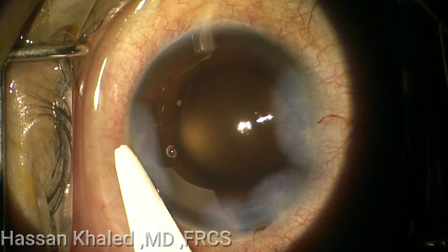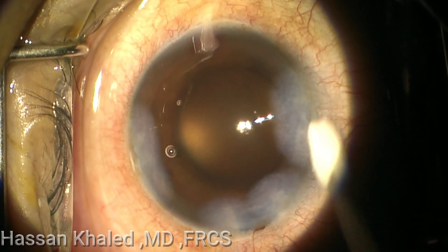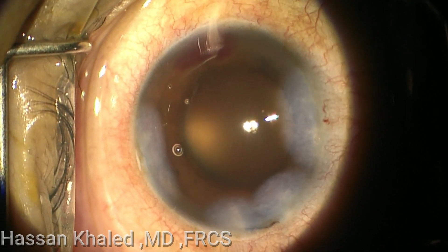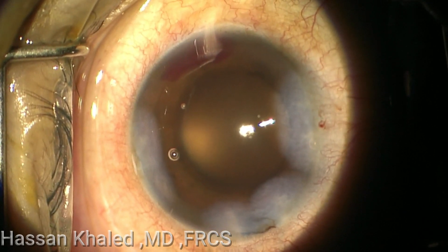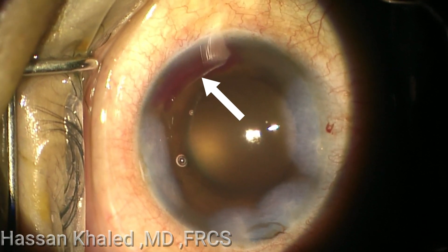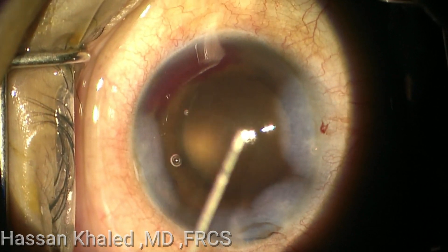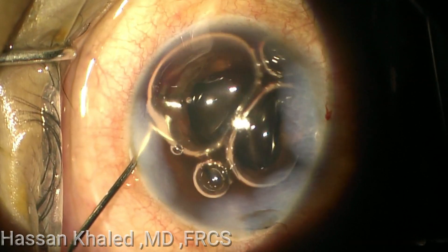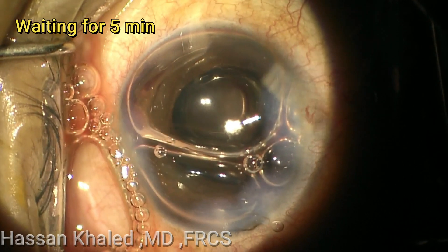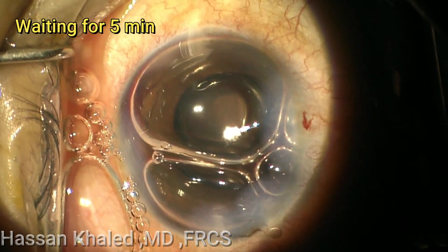It is important to elevate the intraocular pressure and to wait a few minutes to allow the bleeding to stop. You can see now the bleeding at the white arrow. Now I am injecting an air bubble inside the anterior chamber in order to elevate the eye pressure.